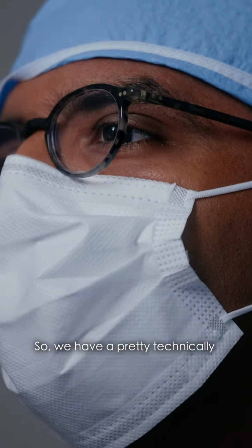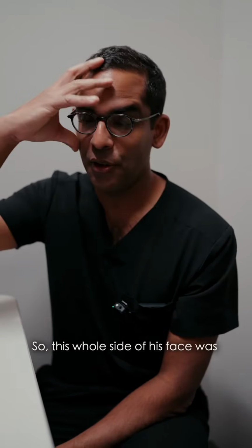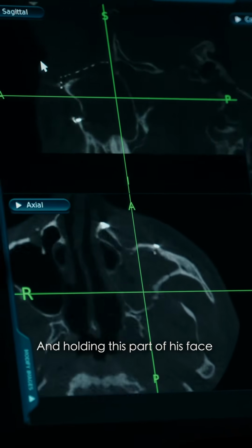So we have a pretty technically complicated case this morning. It's a patient who has a previous history of a really bad facial fracture. So this whole side of his face was completely fractured. And so he has plates in the bottom of his orbital floor and holding this part of his face together.